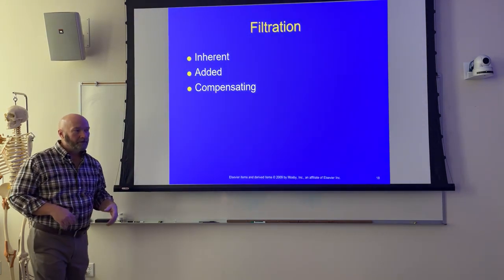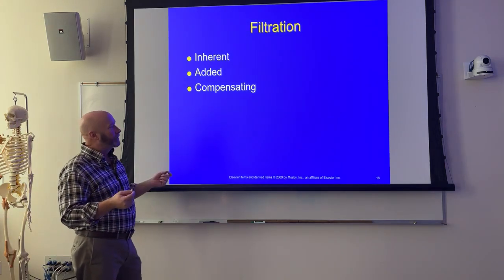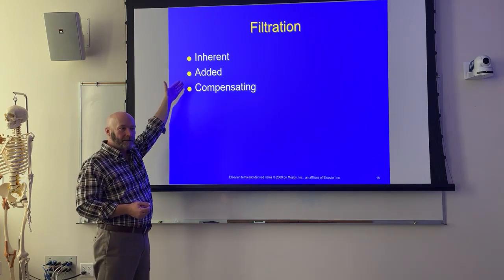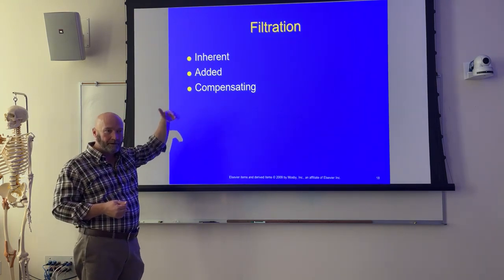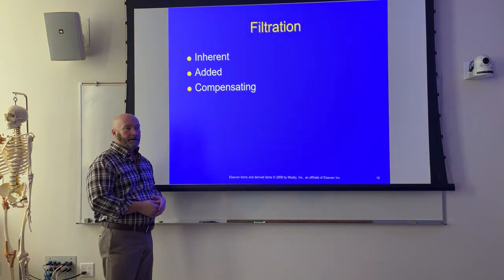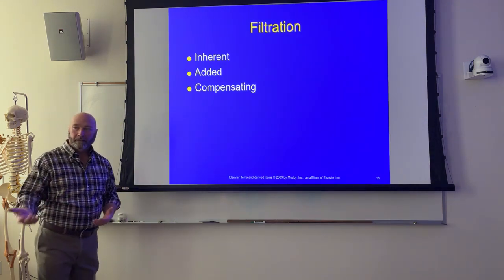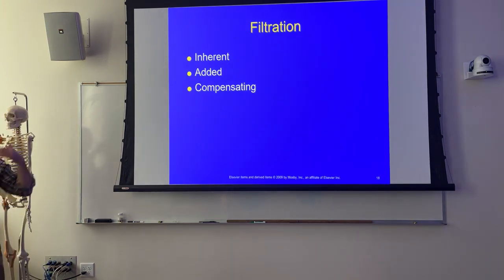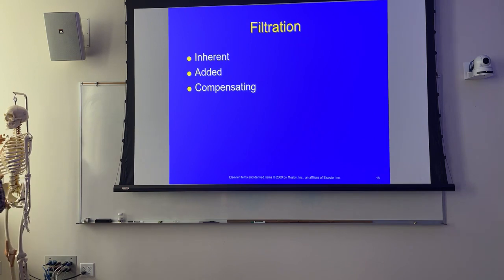Now, could our biomed guy come in and determine how much that tanning has increased inherent filtration and pull some of the other filtration out to bring it back down to 2.5? And the answer is yeah, they could. Are they ever going to do that? And the answer is no, they're never going to. So in your questions, tanning increases inherent filtration. So use the word increases instead of added so that you don't confuse those two. It increases inherent filtration.